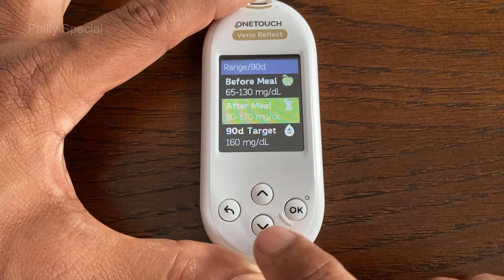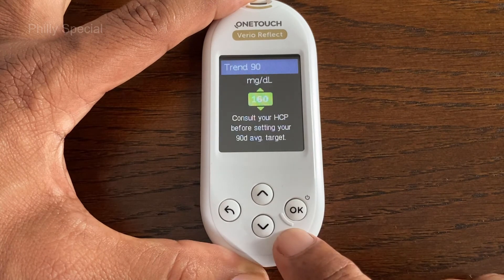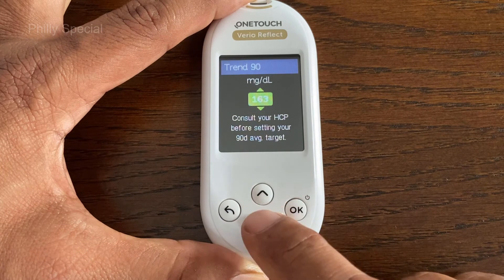To adjust the 90-Day Average Target, highlight the 90D Target setting and press OK. The meter is preset to 155 mg/dL. Once the desired target value is selected, press OK.